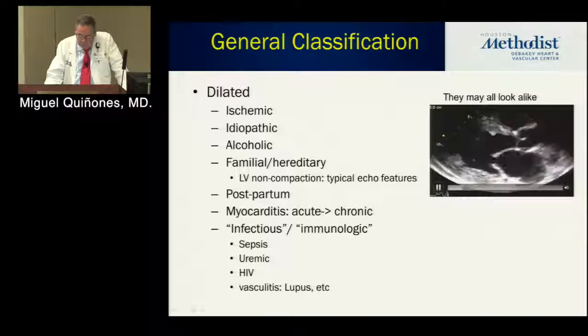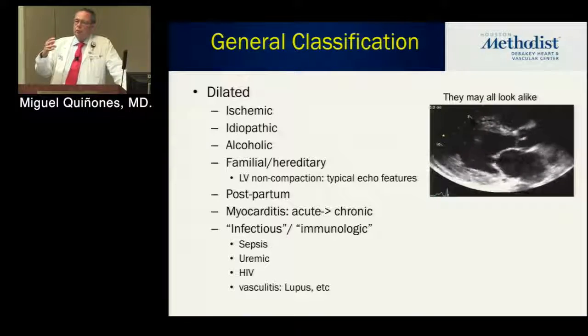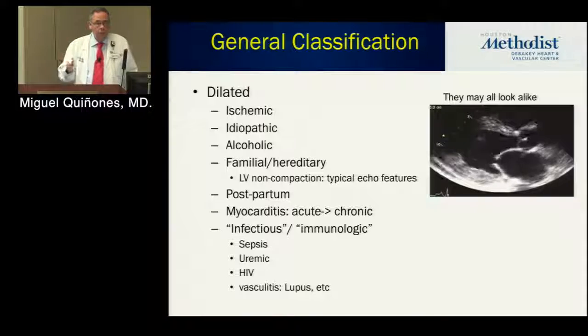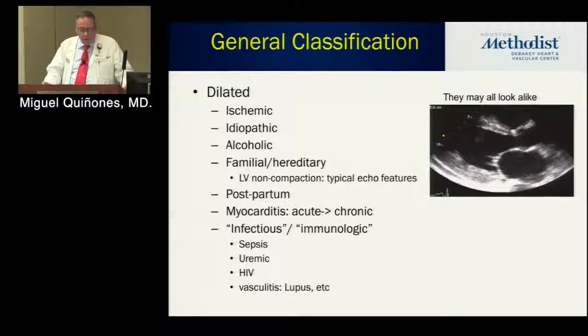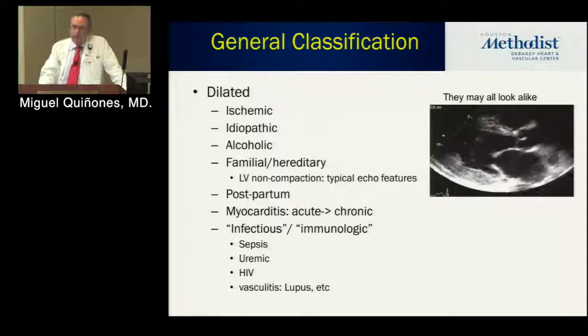Now, if you have a heart like this that is dilated, poorly contractile, but the wall thickness is nicely preserved, that in itself points more to non-ischemic. Now, it still could be hibernation. We've seen hearts that are very ischemic and hibernating, and they kind of look like this. So again, you make a statistical call based on these things, and clearly having an EKG around to look at and a clinical history can be very helpful, because many different etiologies will look like this.